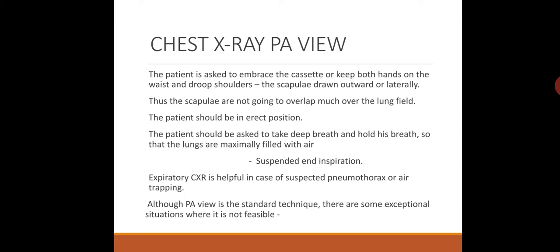Although PA view is a standard technique, and most of the references are made with PA view in consideration, there are some exceptional situations where PA imaging is not feasible.